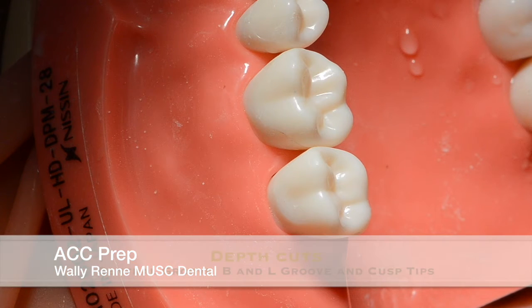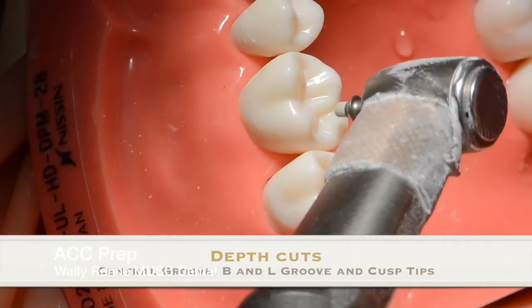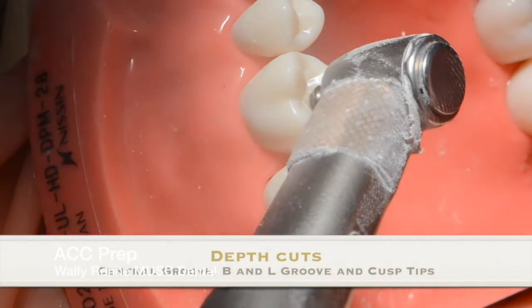If you're using a weaker ceramic or cementing Emax, you go with the 1.5mm depth cut bur.